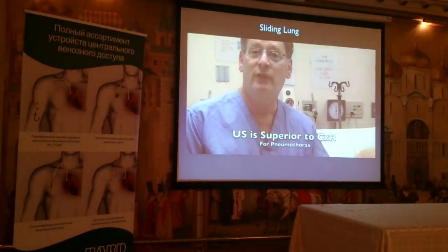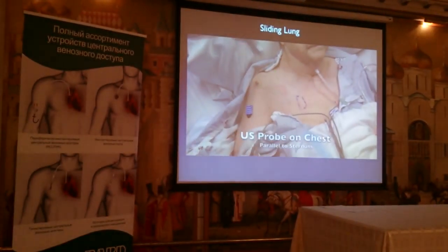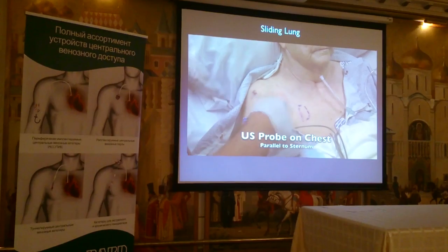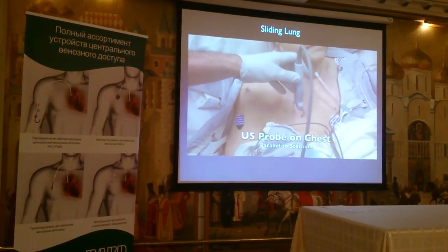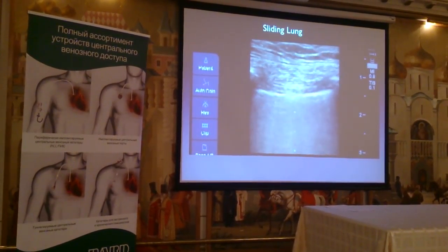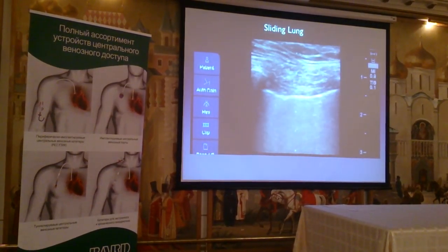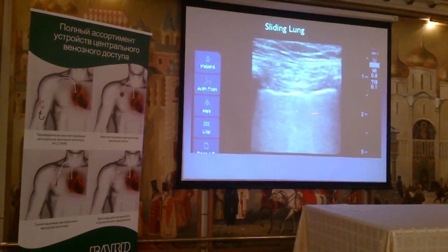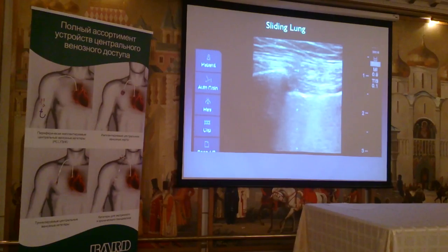The way we do this is we take the ultrasound probe and place it parallel to the sternum on the upper chest. We're going to watch the picture — we can see the pleura, the visceral pleura sliding against the parietal pleura. We can see some nice vertical comet tails, and if we see this, we do not have pneumothorax.